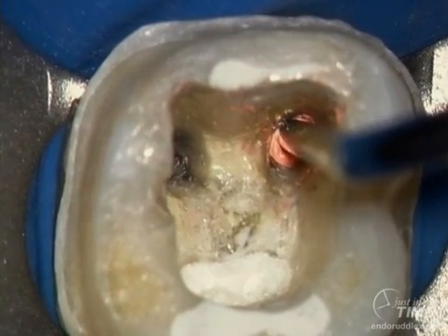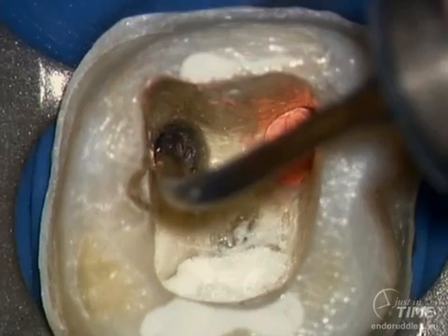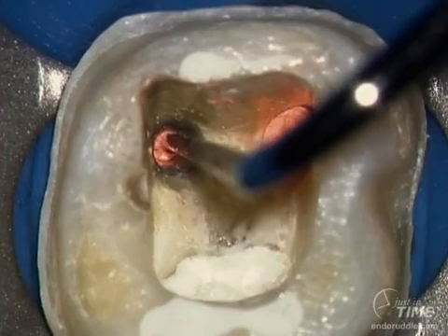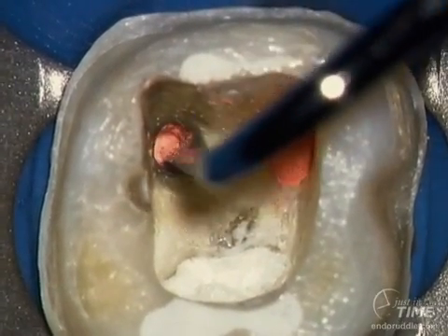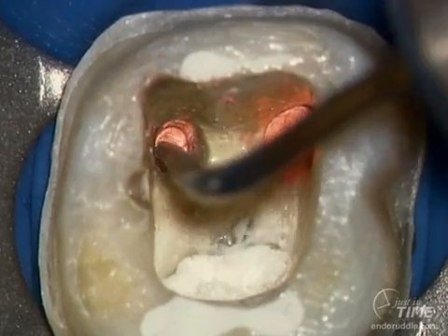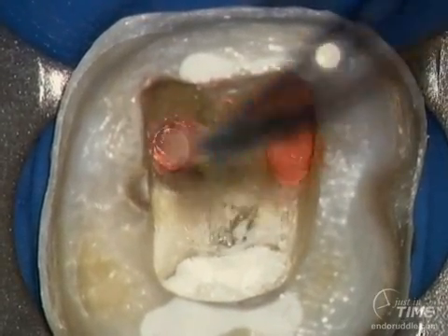And of course, we can backpack the systems every other time, or we can backpack one and then focus and backpack on the other. Either way is appropriate. You can see how I'm deliberately stepping those pluggers around the circumference of the wall. The Calamus Flow cannula is very ergonomic, fits easily into the posterior regions. Thermosoftened gutta percha can be readily compacted, and we can squirt and condense until we work our way out of the canal.